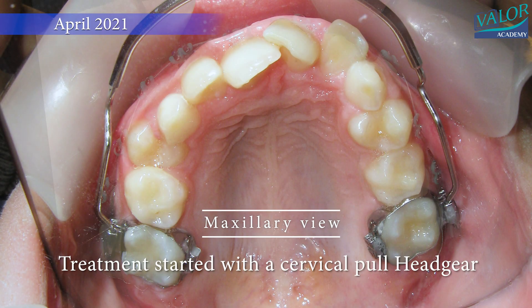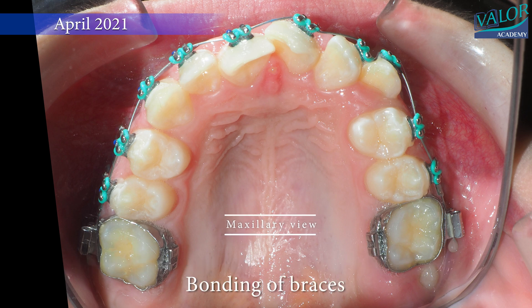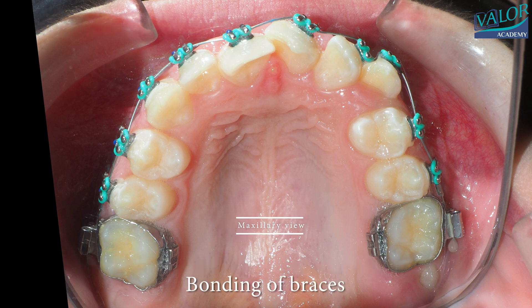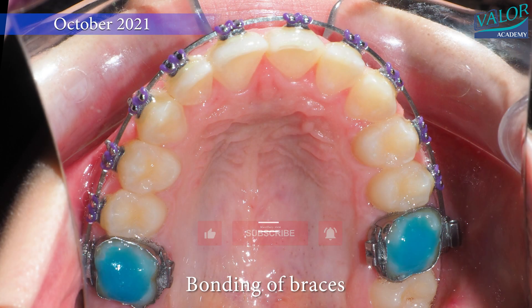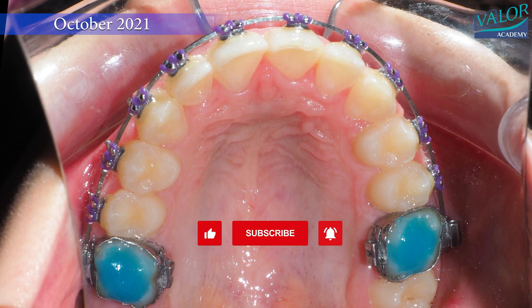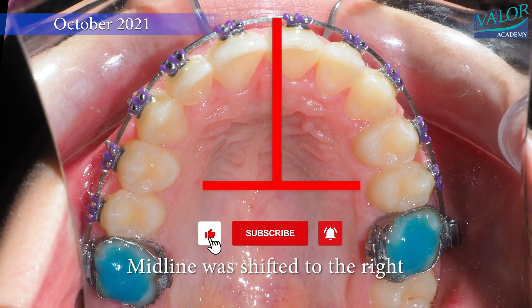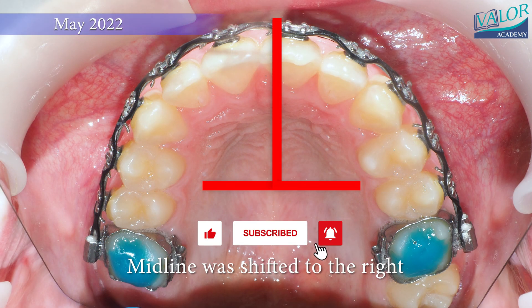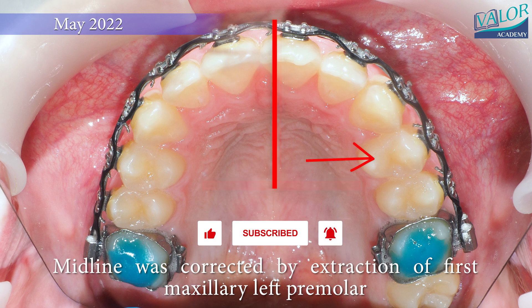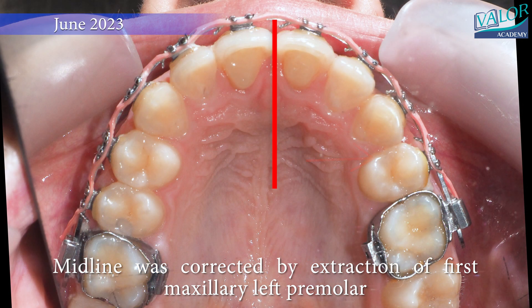The primary goal is to move the maxillary midline to the left of the patient, thereby enhancing symmetry and improving occlusion. By carefully planning and executing the treatment, orthodontists can significantly improve the aesthetics and functionality of a patient's smile.